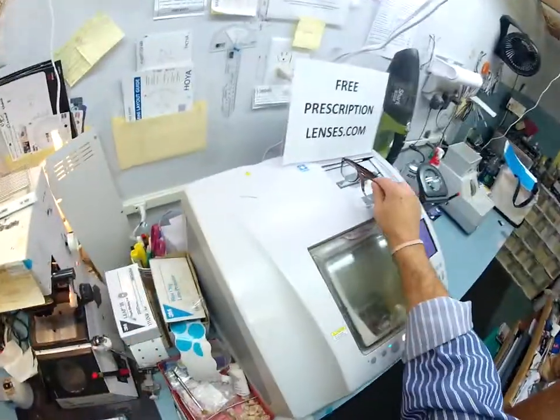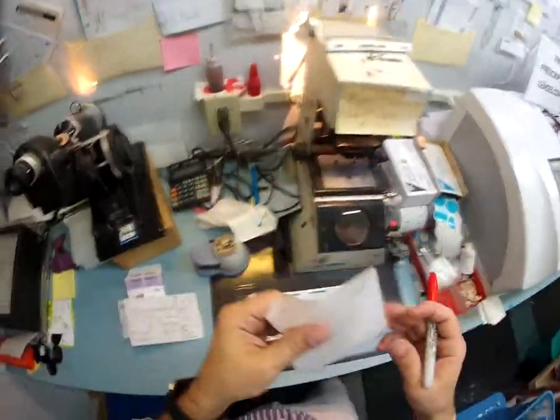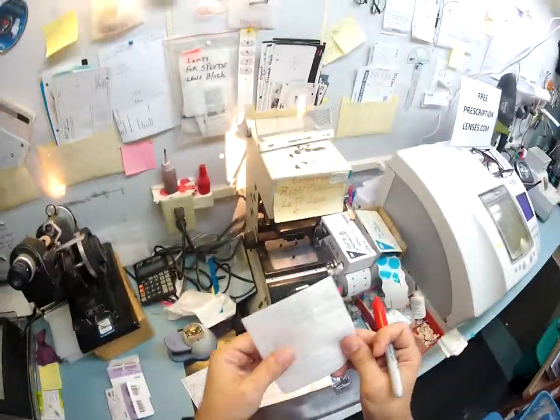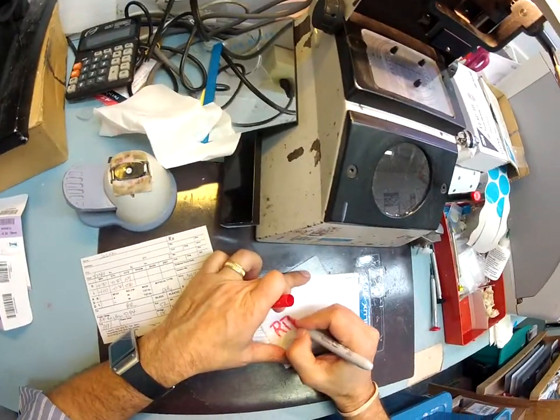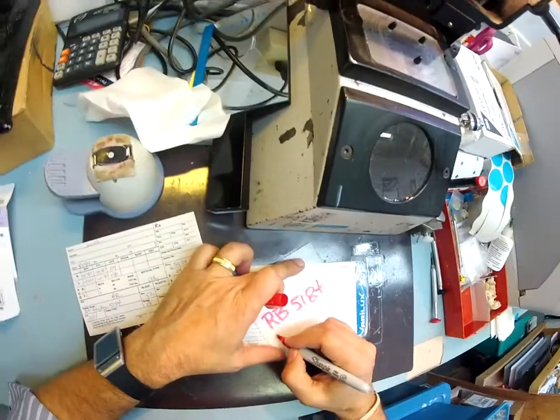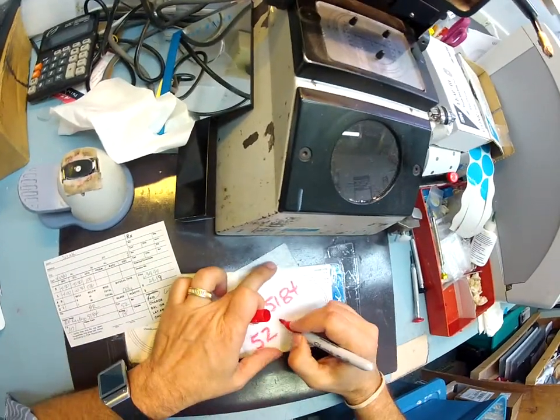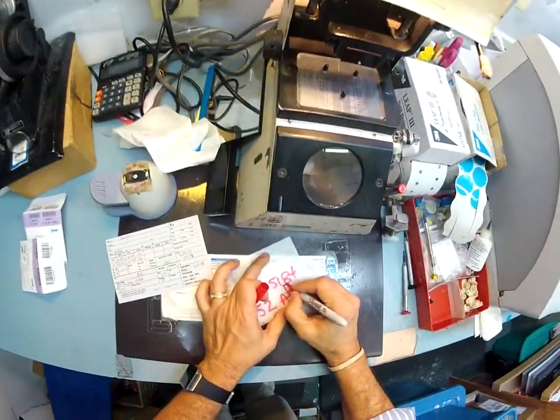And in fact, let me go ahead. These are protective foam sleeves that the invisible bifocals with transitions, anti-glare, polarized lenses that the multi-billion-dollar labs send them to me in. I'm going to recycle these. This is for a RayBan 5184, size 52, with an anti-reflective coating. And of course, they are RX prescription.